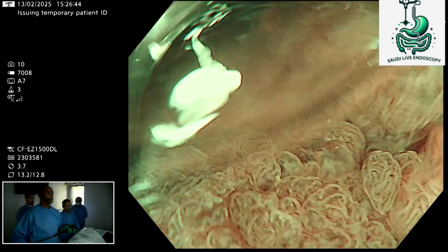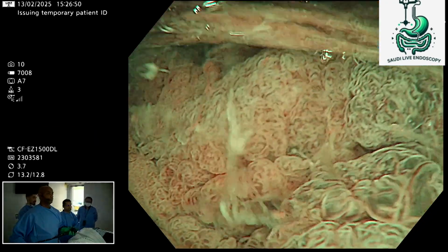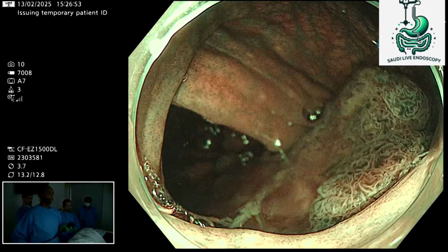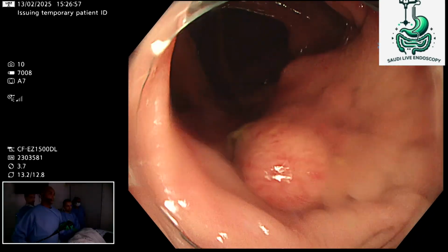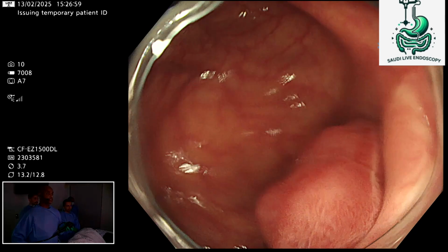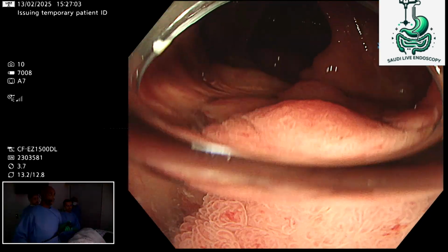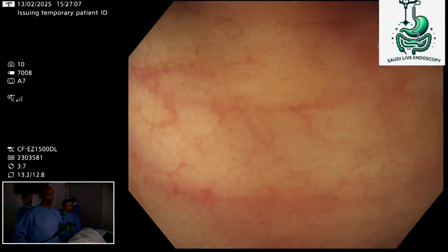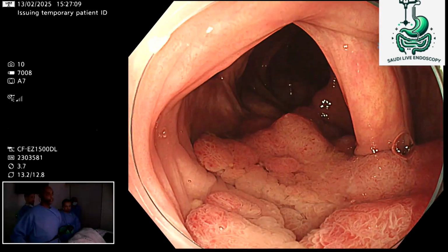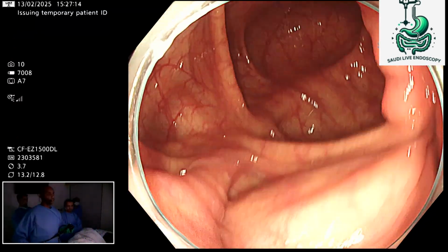Dr. Ammar, how do you assess the size of the polyp, and from where does it start, and what is the classification here with NBI? Yeah, so the classification here is, as we said, a Paris 1S granular. And I think this lesion will probably be at least 50 plus, up to 60 millimeters in length. And obviously when we inject, it's going to be much bigger, almost about 30% bigger.